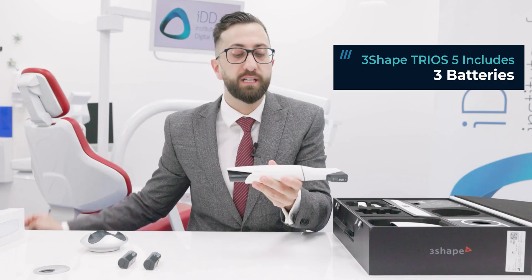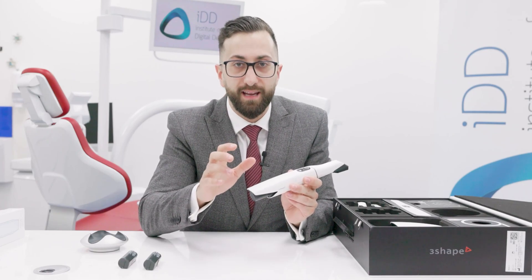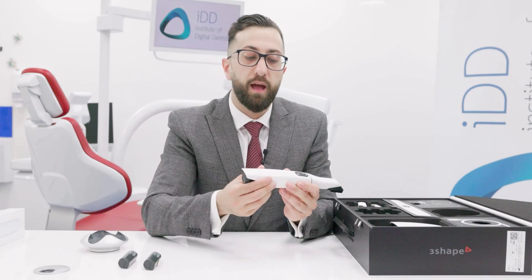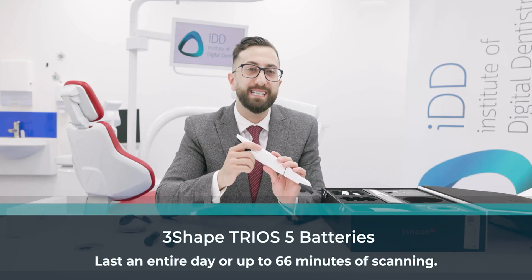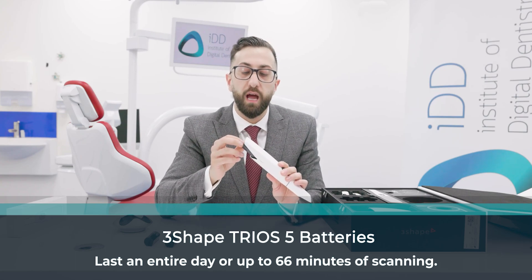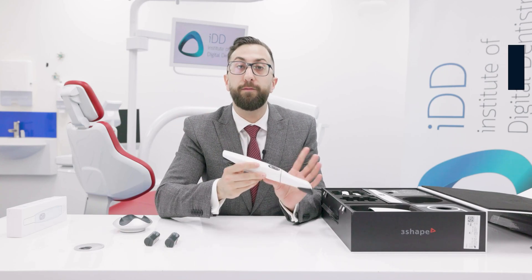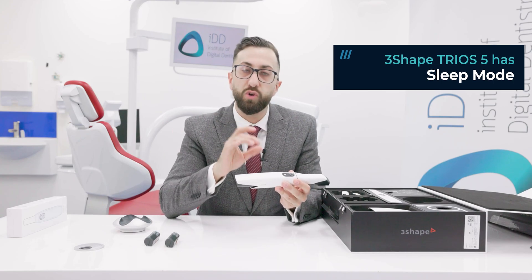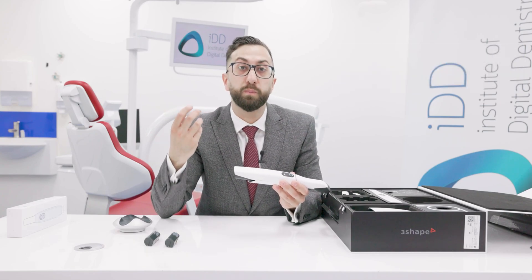Anyone who has had a Trios 4 will know that battery life was actually a weak point for that scanner. 3Shape has completely taken this on board. They say one battery will last an entire day or up to 66 minutes of scanning — a huge improvement over the Trios 4. There is also finally a sleep mode, so when the scanner is not in use, the battery and scanner will go into sleep mode to help preserve battery life.